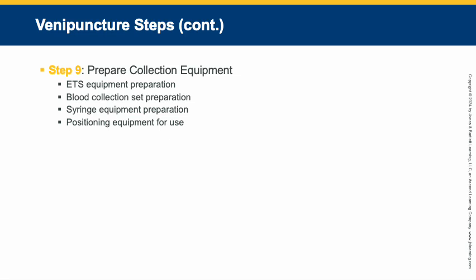Select a new one. Twist off the back cover of the ETS needle to expose the short or the back end of the needle that is covered by a retractable sleeve. Screw this end of the needle into the threaded hub of an ETS tube holder. Do not yet remove the needle sheath, which is the cap or the cover.